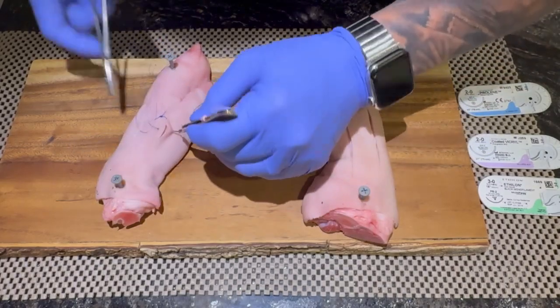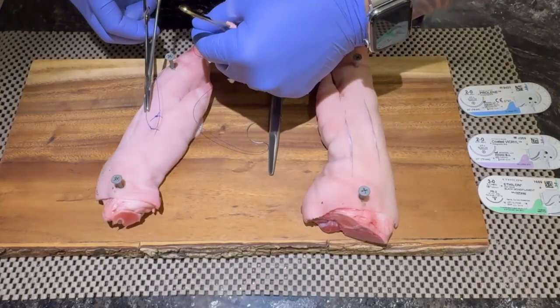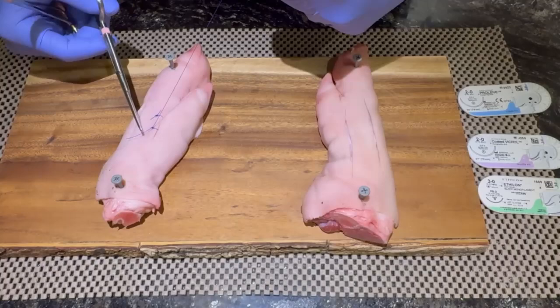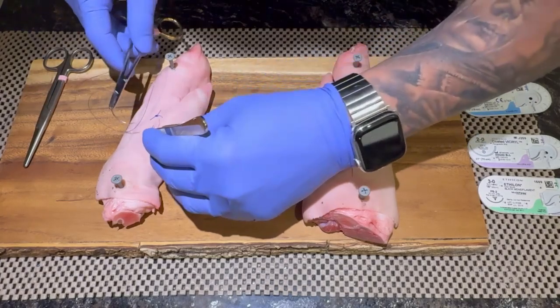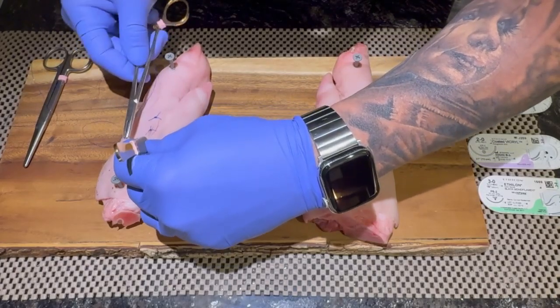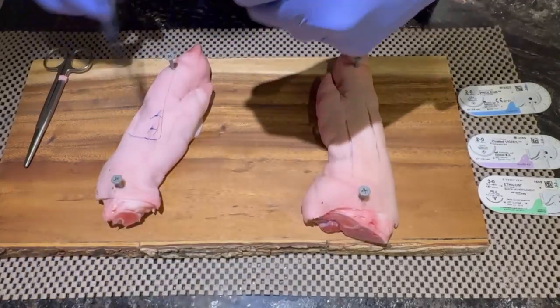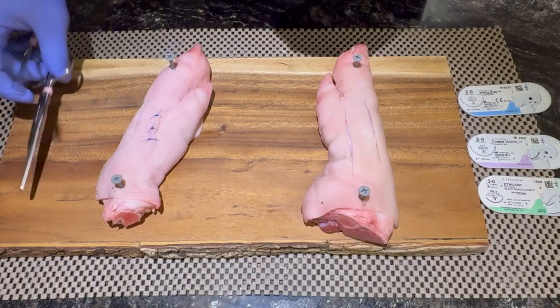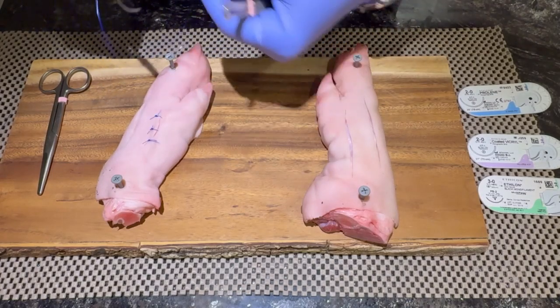These kinds of stitches that we are providing here are called simple stitches, or simple interrupted stitches. You can see how the skin is evenly approximated. Just for the purpose of the demonstration, we're going to go over a couple of different styles of stitches we can use. This all depends on the area where we're using those stitches. We always have to take into consideration if it's thin skin or thicker skin, and if it's in an area of tension or a non-tension area. This, as we can see, was just simple interrupted stitches.